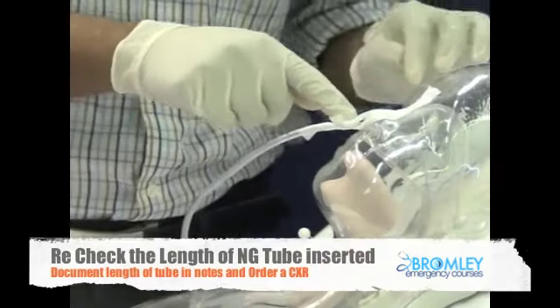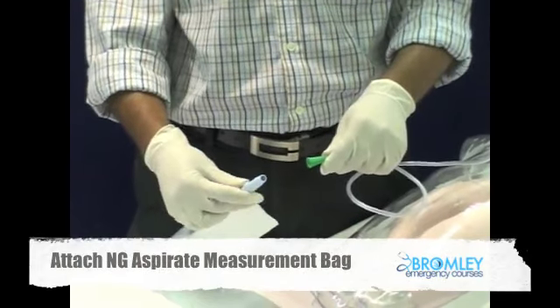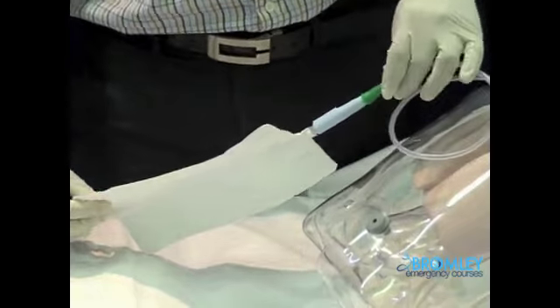Once we're done with that, note the marking and document it in the notes. Having aspirated the NG tube, you've got to connect it to a bag, so there's a free drainage. This is how we can measure the aspiration as output, fluid output.